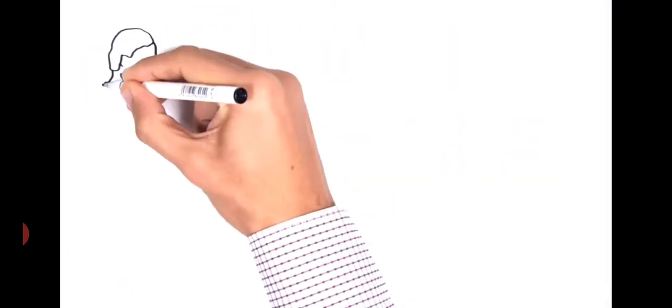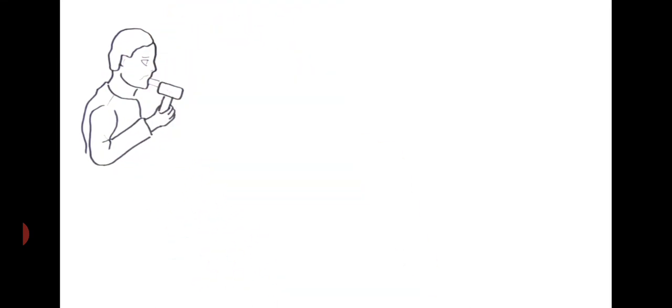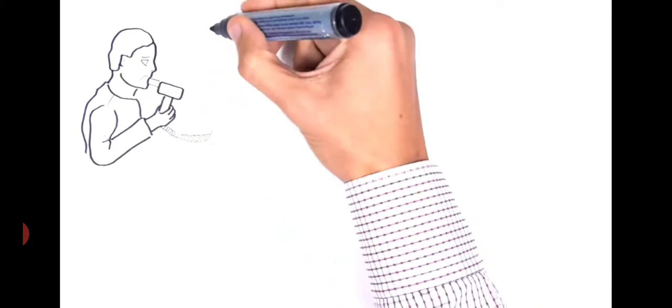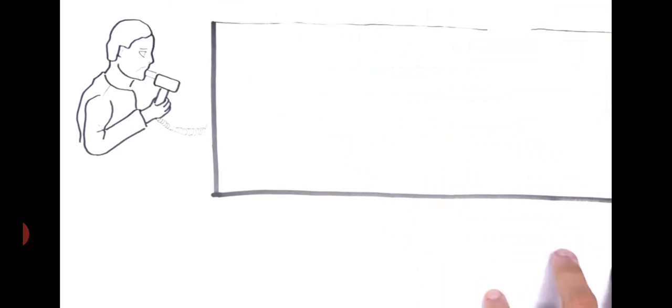In this video, we're going to look at spirometry and look at the differences between normal, obstructive pulmonary disease, and also restrictive lung disease. It is a good idea to recap the lung volumes and lung capacities before looking into this video. So one way to monitor lung function is by using a lung function test, such as a spirometry.